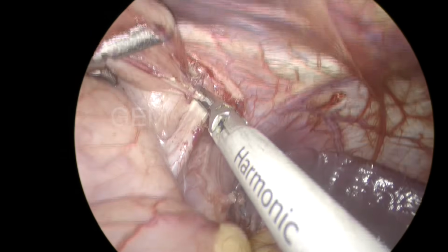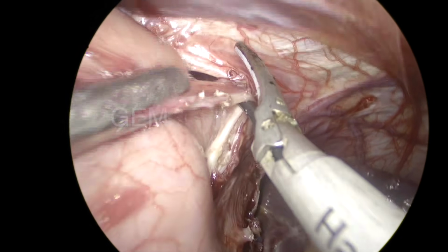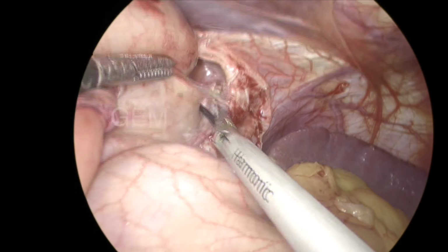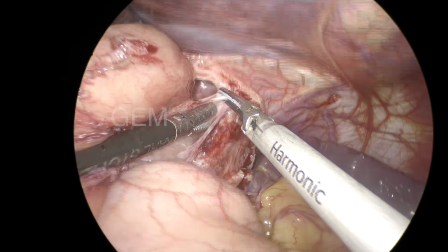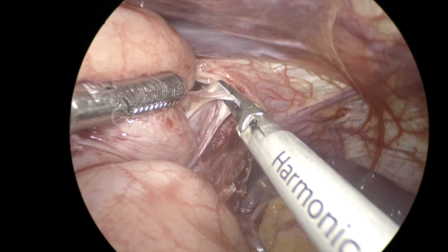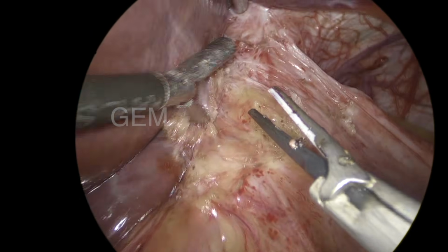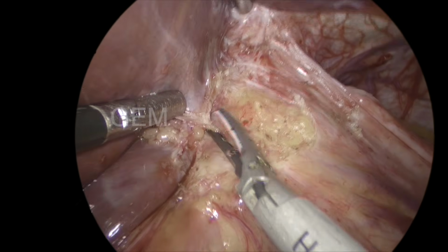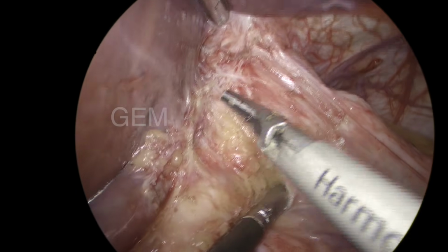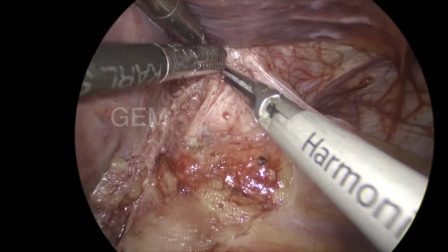So these are adhesions to the crus. There is a left pillar of the right crus. Once you find the sac, we have to take out the complete sac. In this patient, you can see the sac going inside the hiatus. So I didn't continue there. I come on this lateral side. So I started releasing the liver surface from the previously dissected site.